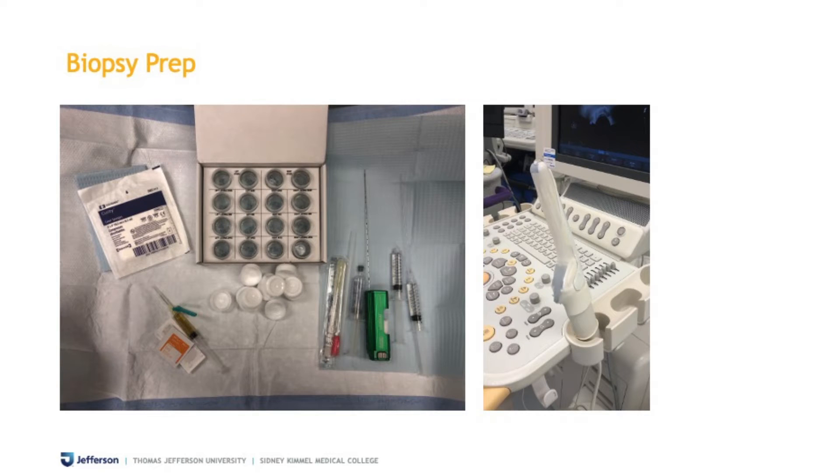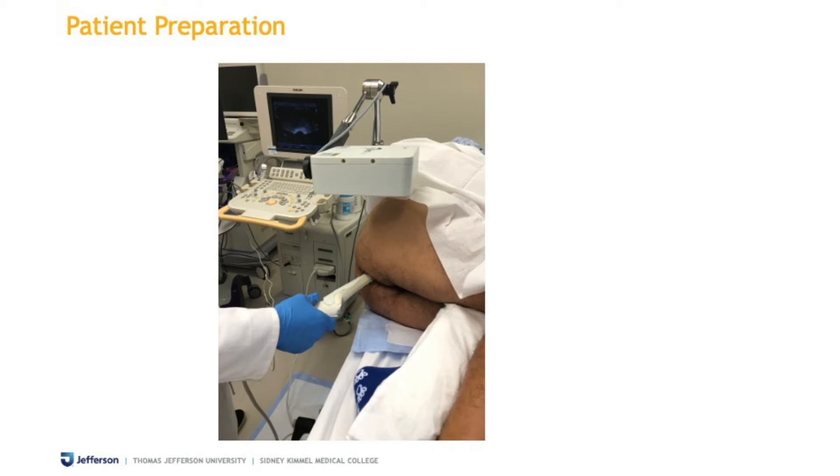This is the typical setup of the biopsy table. The patient is in the lateral decubitus orientation. We have the MRI electromagnetic positioning box over the patient's buttocks, and I've inserted the probe into the anus. There is a corresponding electrode that attaches to the probe that allows the system to know exactly where the probe is in real time in relation to the electromagnetic positioning box.